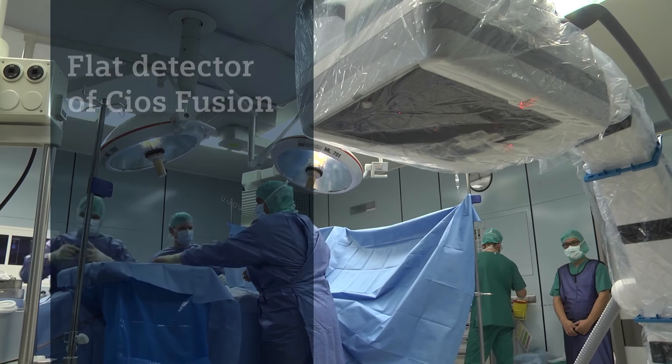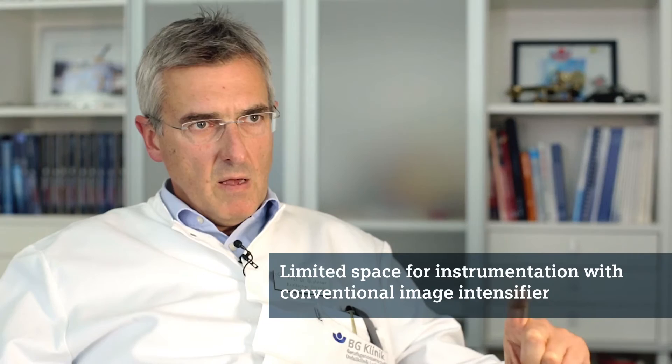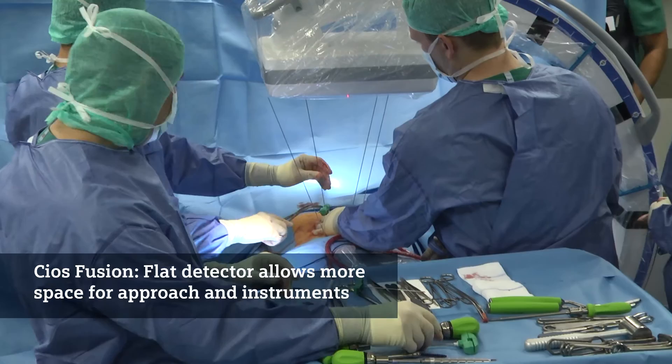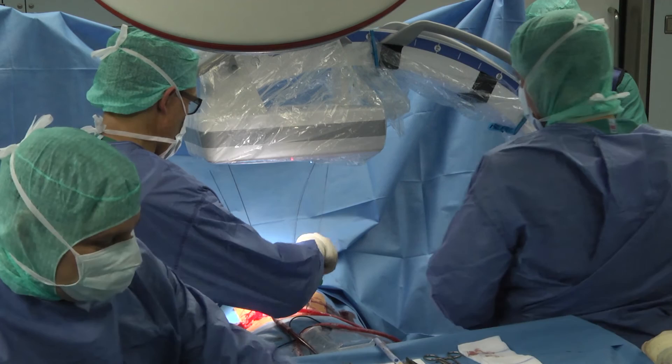With a conventional C-Arm you have to move the intensifier very close to the patient to get a broader image, which means you have a very narrow space between the surgical approach and the image intensifier. With a flat panel you have more space between the approach and the C-Arm, so you can much more easily position your targeting devices and instruments. That's really the difference.